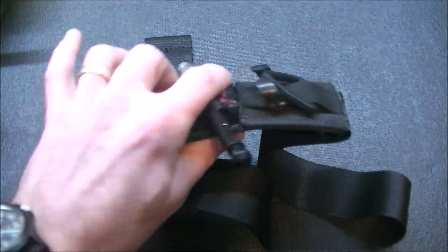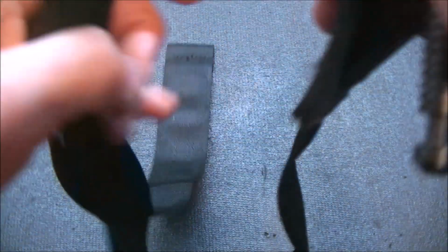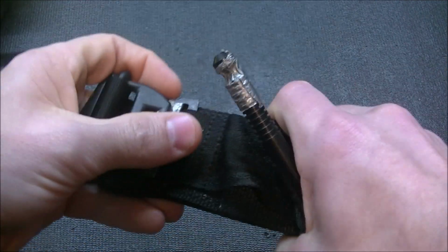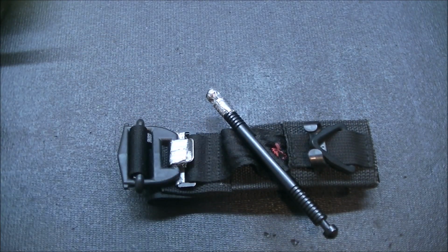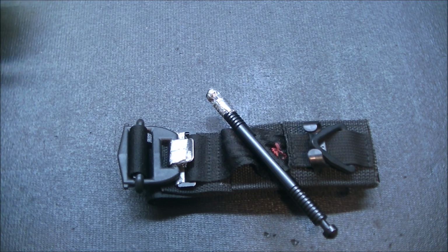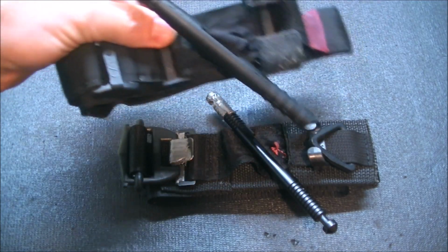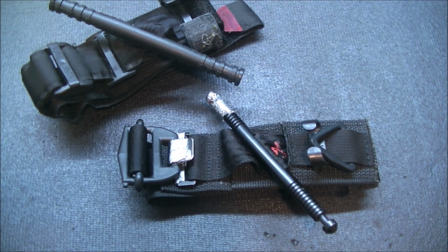So also, this thing does not hold form. When you fold it up, obviously these straps are loose. And it's not like the Velcro of the cat tourniquets that holds the form in place. This is how I have it in a cargo pocket if I'm wearing camis or a uniform or even my concealed carry cargo pants. That's how I'll carry a tourniquet. It's basically the same way I carry the cat tourniquet. It's just done with the SOFTT wide instead. So, you got to find a way to carry it and store it appropriately.